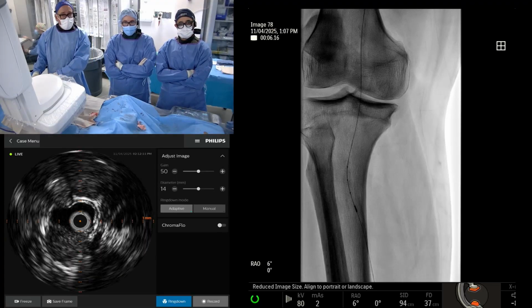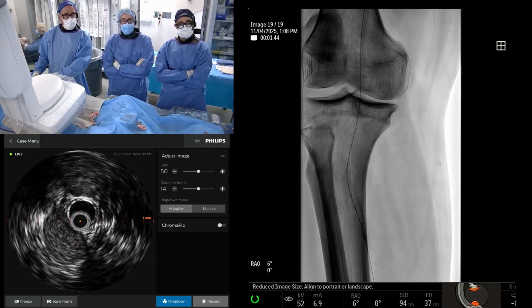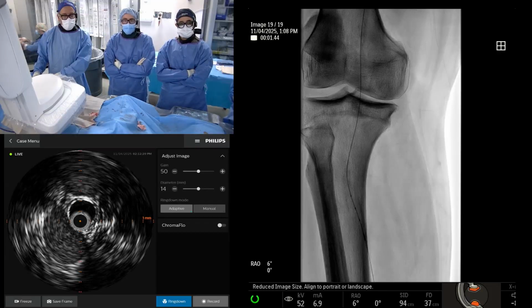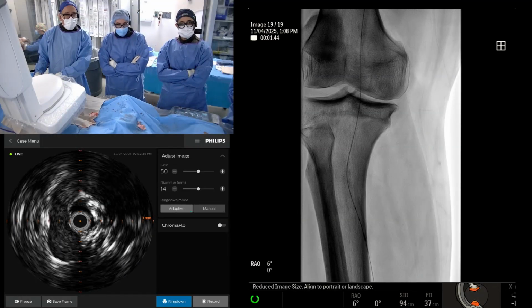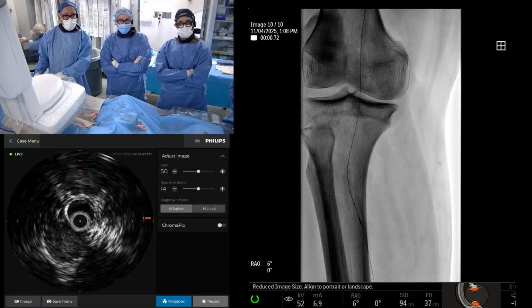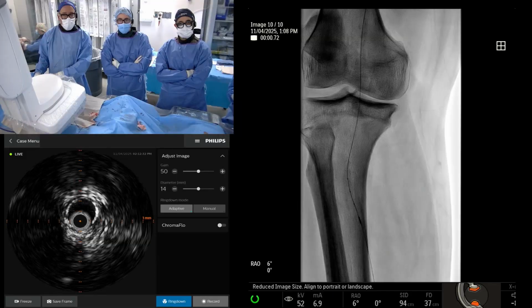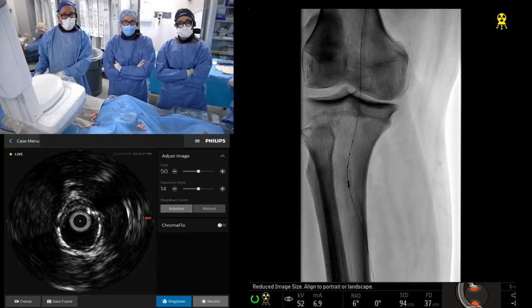So you can see, I think on the screen, Flora for a second. I just want to make sure where I am. So I'm in the proximal to mid peroneal. I'm going to do a pullback. Posterior tib. Sorry, posterior tibial. Thank you. I'm going to do a pullback, and you can see this is falling apart a little bit here. Rob, you're in the PT, correct? Yes, I'm in the PT. I misspoke before. I'm sorry. That's the peroneal.